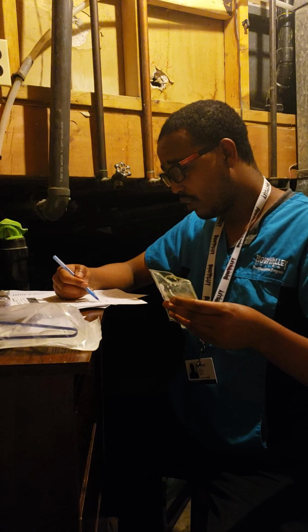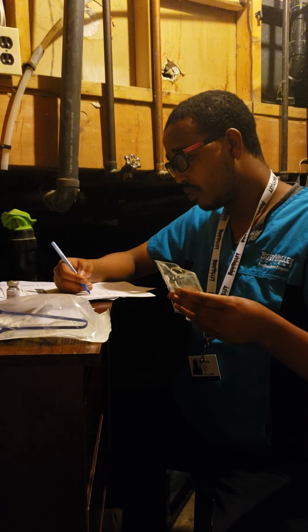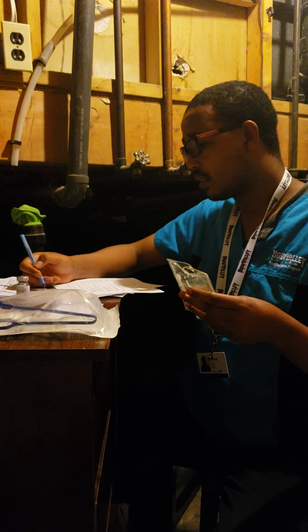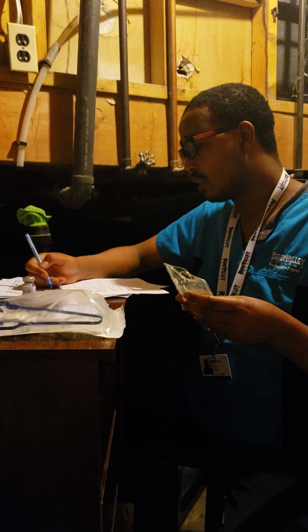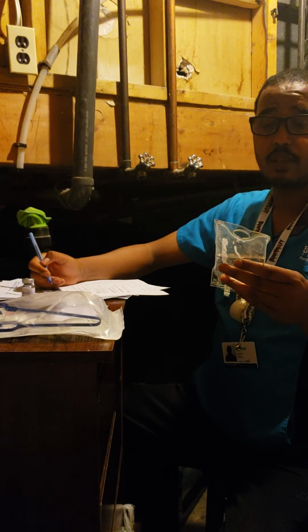On the monograph I have to dilute in normal saline, and the amount is 50 to 100 ml mini bag over 20 to 30 minutes, and the reason is I have to use it for intermittent infusion of medication. Okay, I have done my second check.